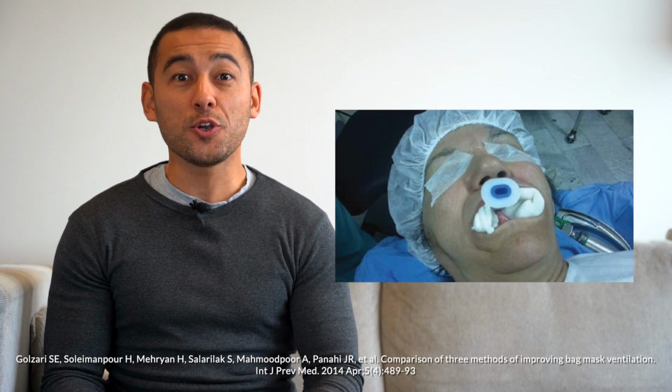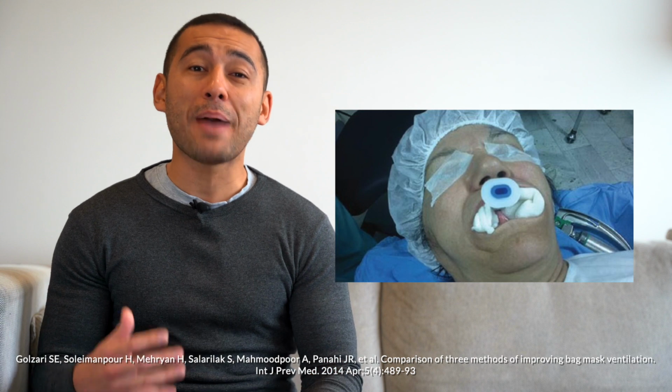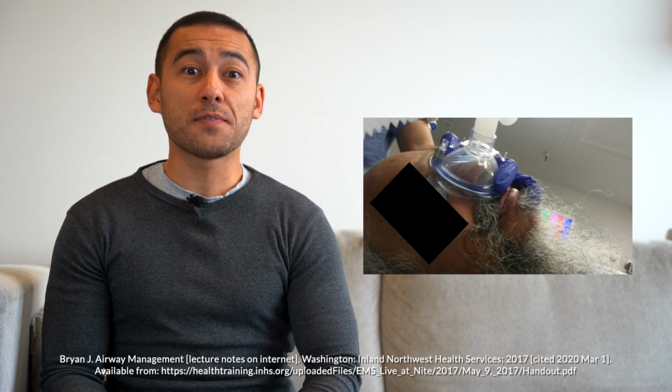In patients with no teeth, improving the mask seal may require putting dentures back into the mouth, bunching the cheeks, or resting the bottom of the mask against the lower lip. If none of these techniques work, you can even try removing the dentures and packing gauze into the buccal cavity. When it comes to patients with facial hair, improving the mask seal may involve clipping the beard, applying an occlusive dressing around the beard, or using a pediatric face mask to ventilate the nose while the mouth is closed.